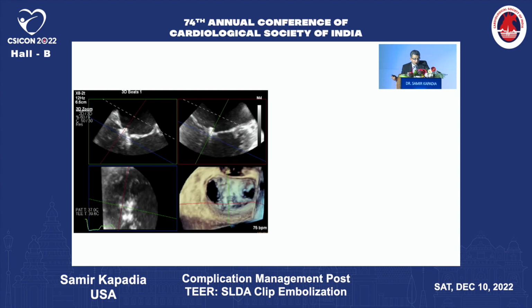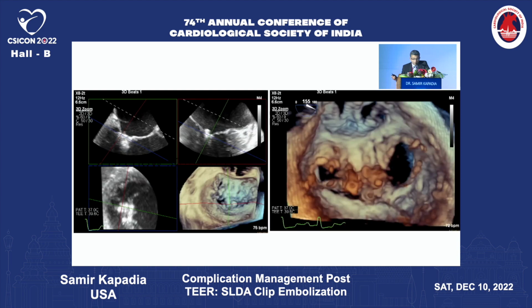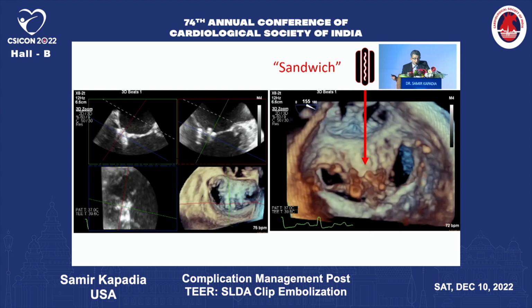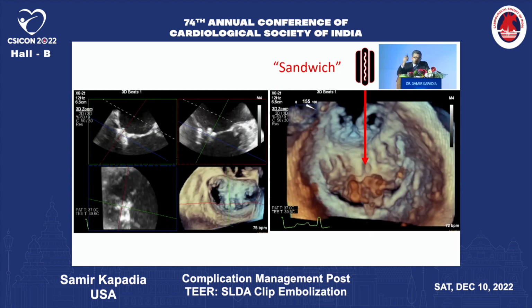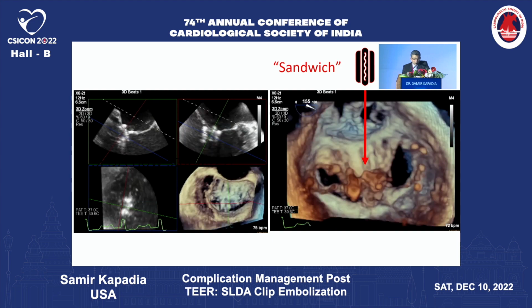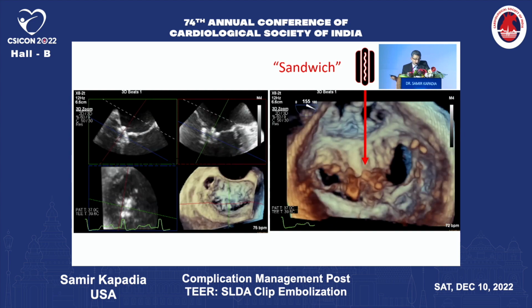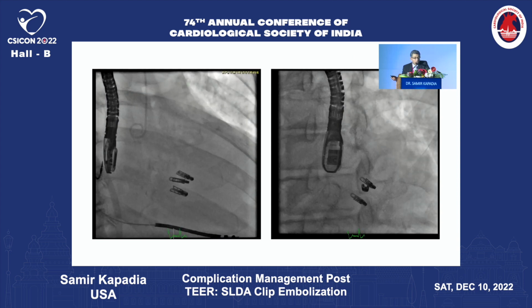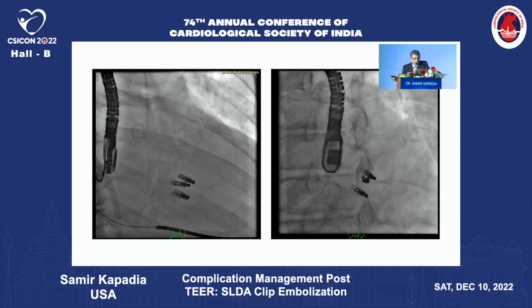So in this particular patient, we decided to put the clips on both sides of the torn leaflet, because if the leaflet is torn, there is no way to catch the leaflet. So we put the clips on both sides, I call it a sandwich, between the 2. And you can see here that the clip is detached and the other 2 clips are holding the two leaflets.